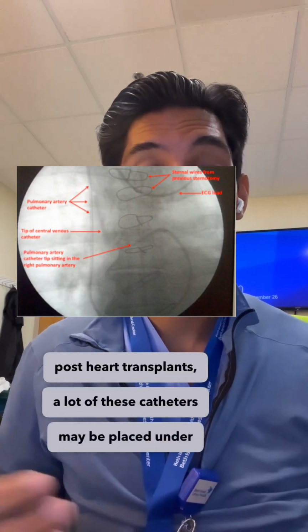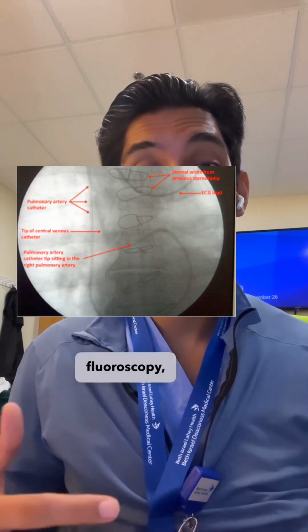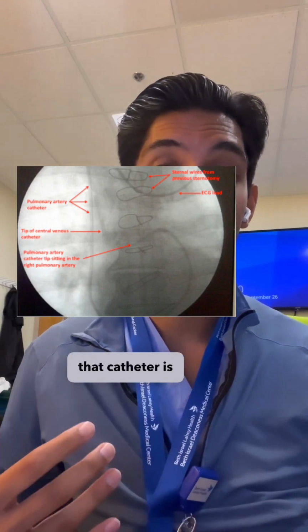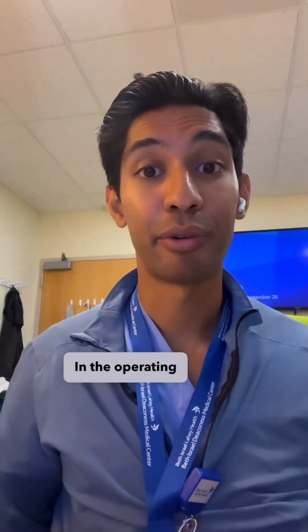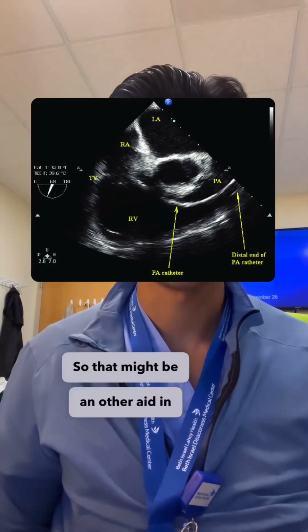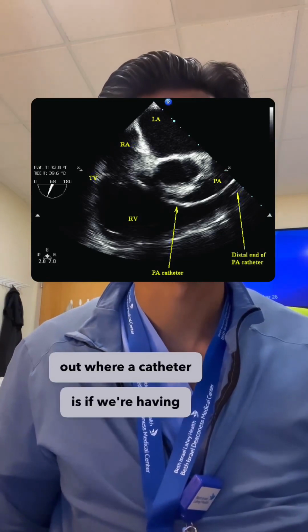Now, patients who have more complex anatomy, like if they're post-heart transplant, a lot of these catheters may be placed under fluoroscopy, like in a cath lab, and that's where they take x-rays to really get an estimate as to where that catheter is as they're advancing it. In the operating room, we also have the advantage of using transesophageal echo, so that might be another aid in helping us figure out where a catheter is if we're having trouble placing it.